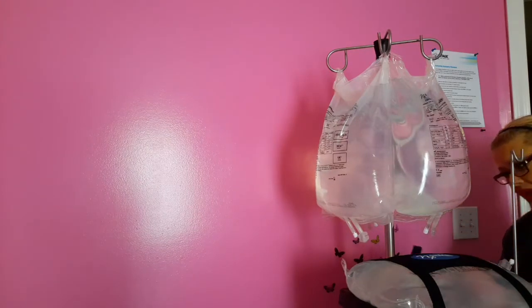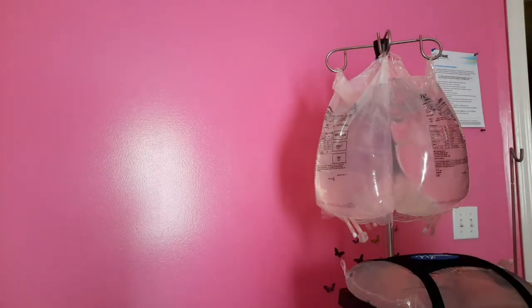Alright, then we're going to plug in our warmer, which you just take the cord from the back and just plug it in. Come on. Alright, and we'll wait till we see some yellow lights.